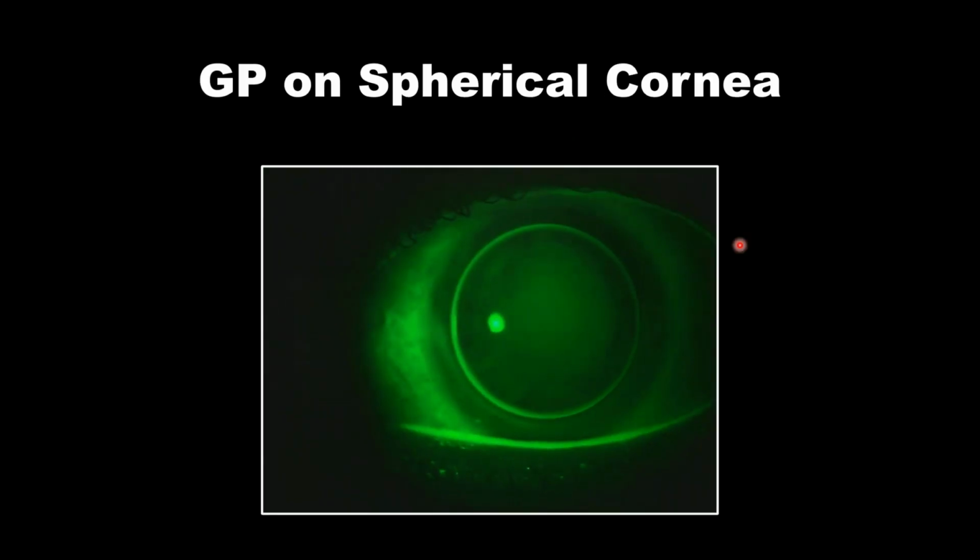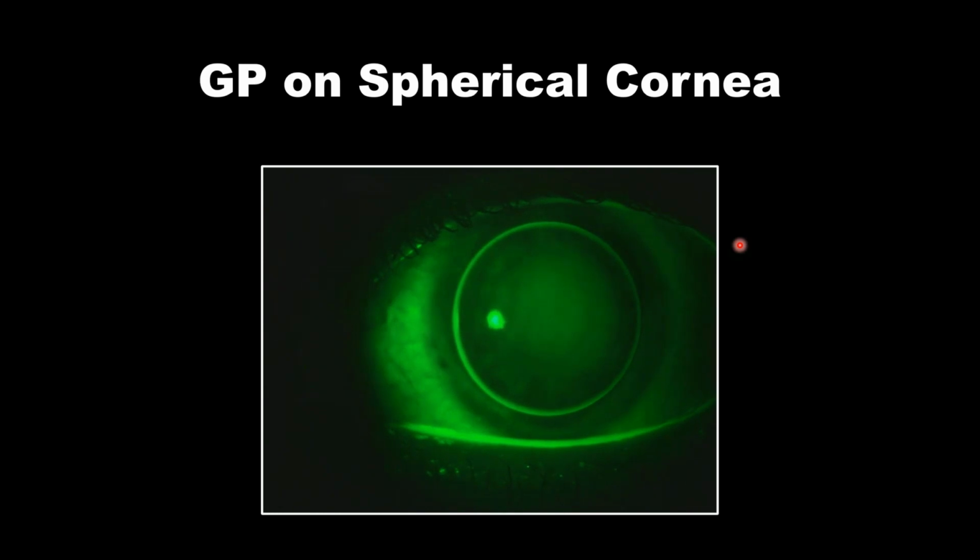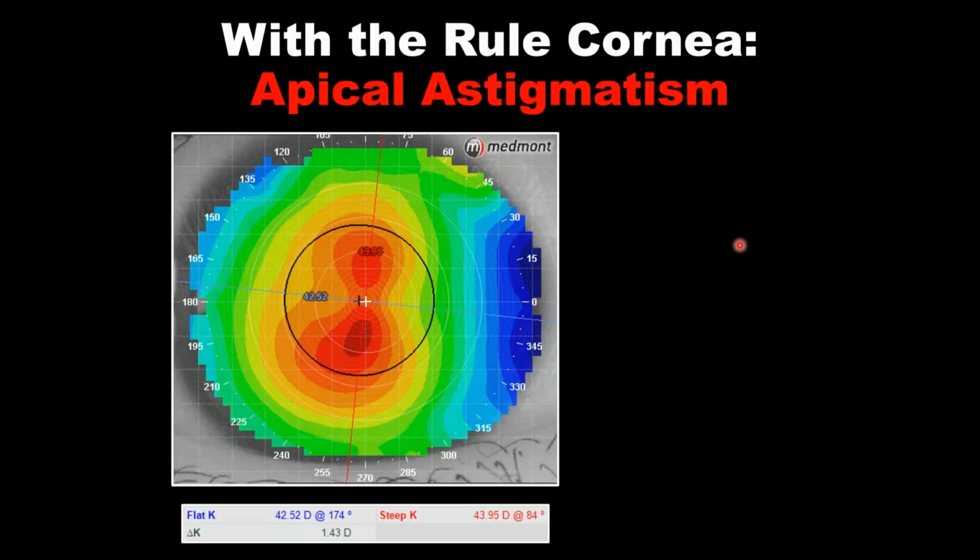So when you place a rigid contact lens on this patient, it's very likely to find good alignment all the way around. And any movement that exists might be due to that tiny 8 micron channel that exists along the steep meridian of the eye, the 8 microns deeper that you are across the steep axis. Of course, lid force and gravity are going to play a big role in contact lens movement, but surely the eye shape does matter.